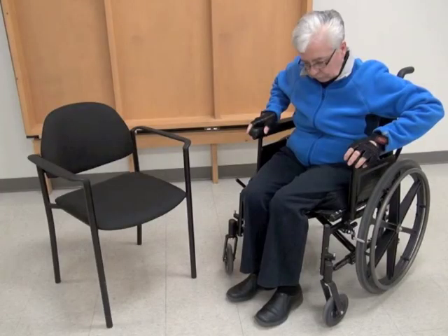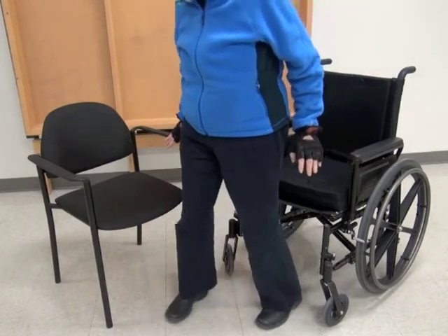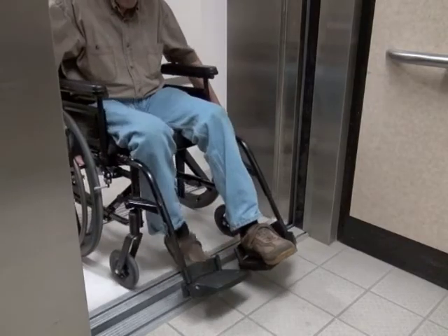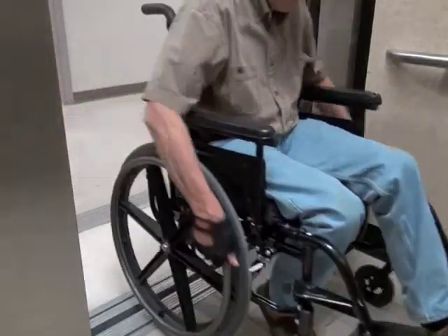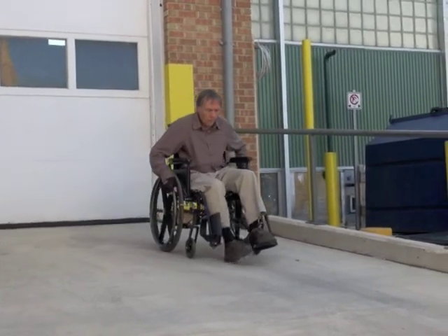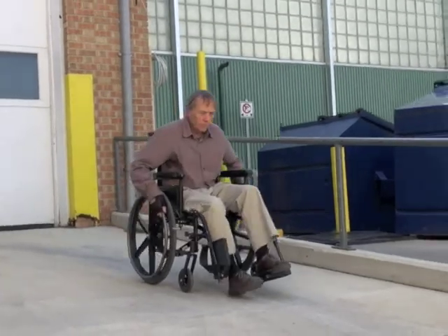Swinging or flipping the footrest out of the way can be useful for a variety of things while using a wheelchair. Getting in and out of the wheelchair is much safer when the footrests are not in your way. Some people use their foot to help propel the wheelchair or to get over small obstacles. However, you should be very careful when propelling the wheelchair with the footrest up, especially on sloped surfaces, as you can injure your leg if it gets caught up under the wheelchair.